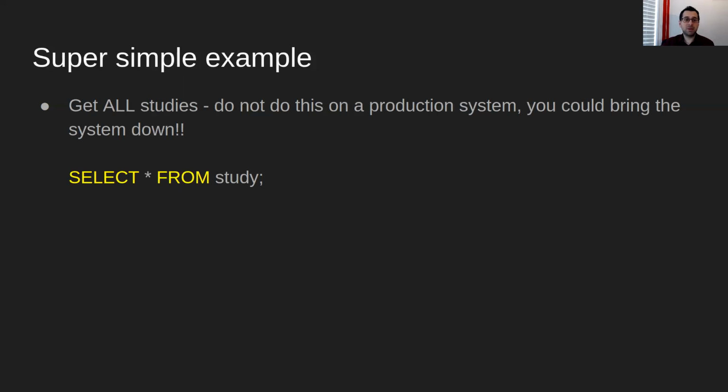So in this case, I'm saying, give me all the studies in the system, because in my case, my system has a handful of studies. Not too many. So I know in advance what the result looks like. I'm just showing you a super simple example. You'll also notice throughout my slides that I'm highlighting SQL vocabulary. So that's the vocabulary you use here.